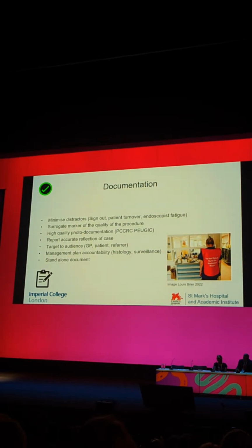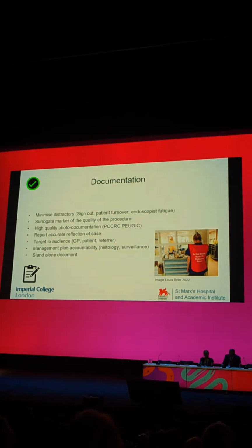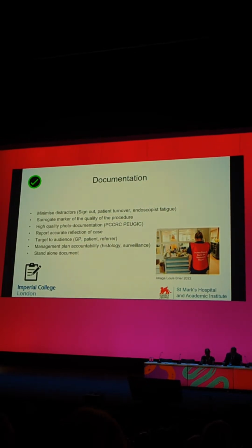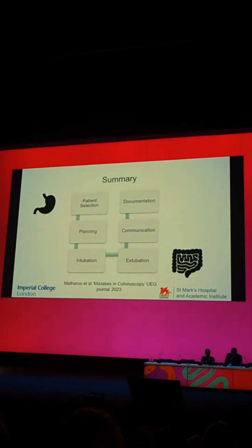And really, I like to think of my endoscopy report as a standalone document, such that if my patient were to present with a complication at another hospital, that report is not just a technical summary of the endoscopy, but a clinical narrative of what I did, why I did it, and what the outcome was.